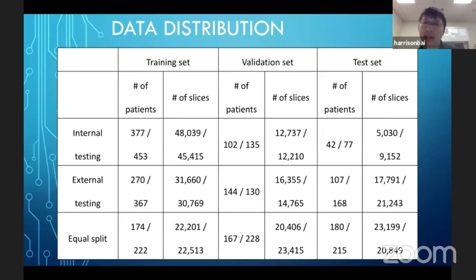So for our training, validation, and test set split, which I mentioned earlier, for the internal testing, we split it in the 7:2:1 ratio, and external testing was done by leaving out data from three institutions, and then finally we split the training, validation, and test set into approximately equal sample sizes.